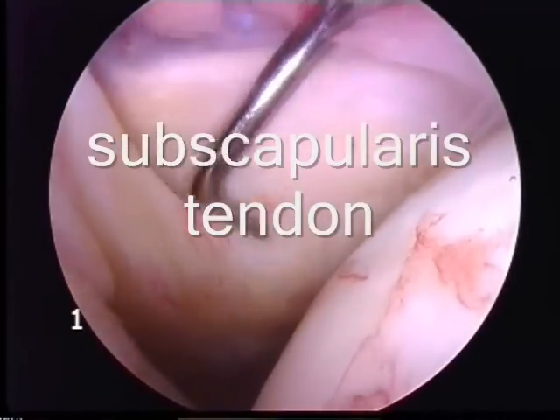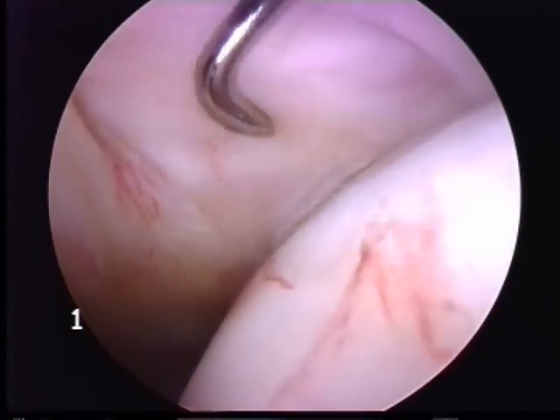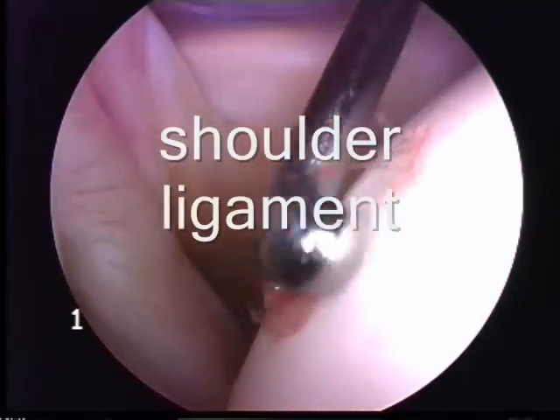This is the subscapularis tendon, one of the rotator cuff tendons, which lies towards the front of the shoulder joint. Just behind it is the middle glenohumeral ligament.